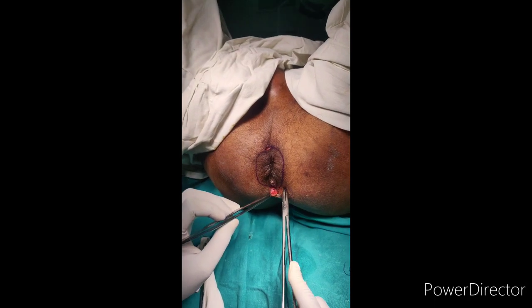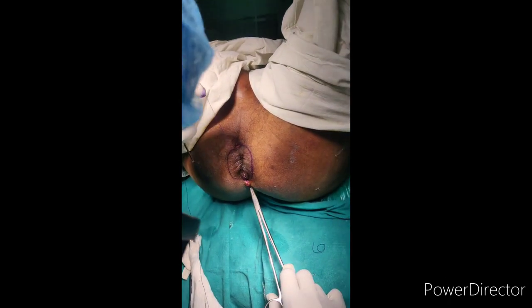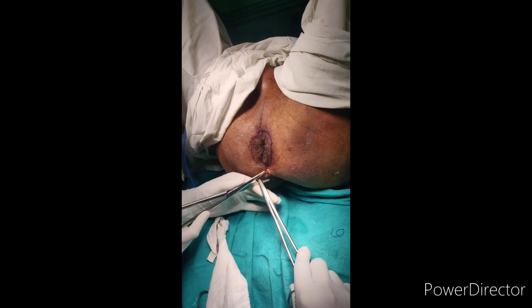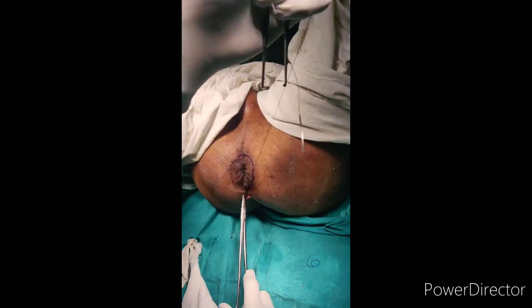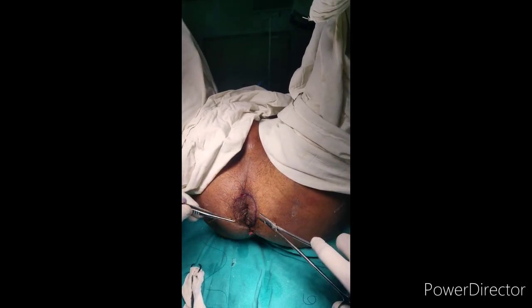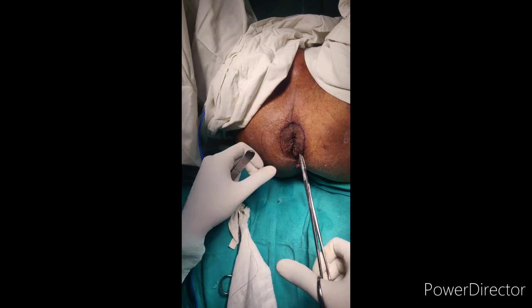The goal of this procedure is palliation. It is not indicated in cases of adult rectal prolapse due to higher recurrence rates. Good results are seen in high-risk, very debilitated patients and children. This procedure was done for teaching purposes. After the first stitch is complete, the entry and exit points are closed, cleaned with betadine, and the procedure is completed. Thank you so much.